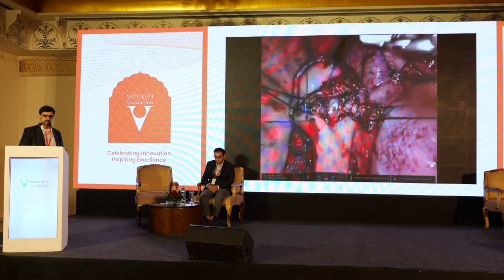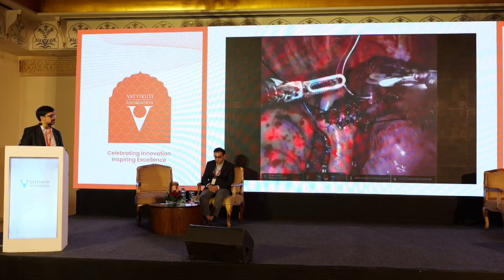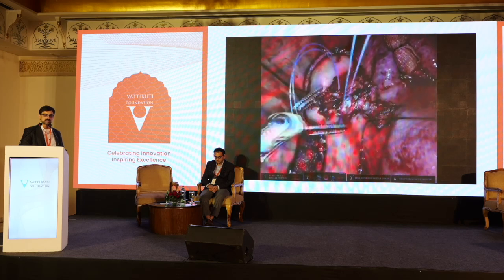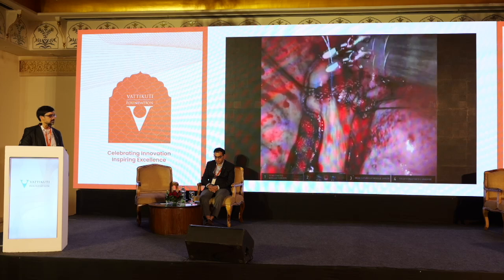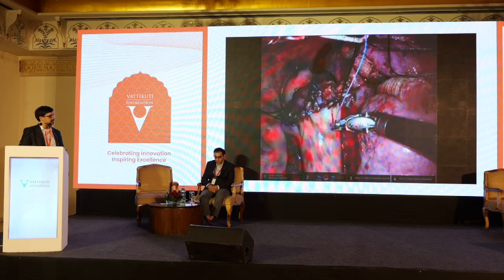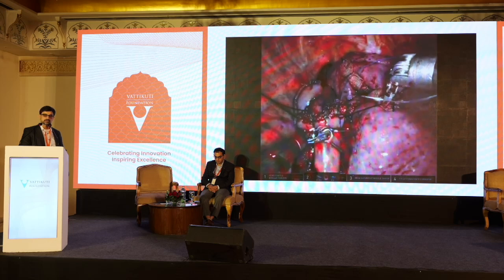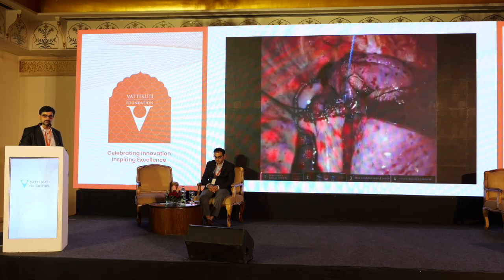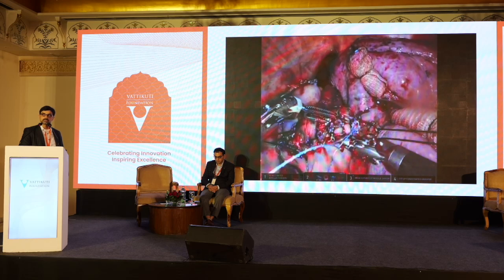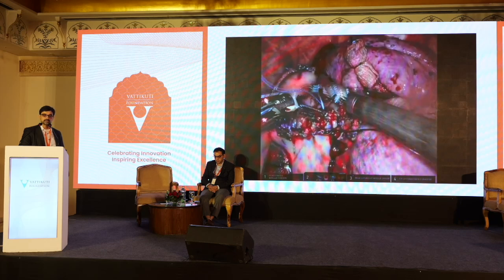At the end of it, my time is about to run out, but at the end of the anastomosis, we'll irrigate and then submerge the anastomosis in saline or water, whatever the case may be, and then I'll have the anesthesiologist blow usually about 120 cc's of air into the esophagus and ensure there's no leak of air. And so this has turned out to be the most consistent way that we've done a totally intracorporeal, totally portal-based anastomosis.